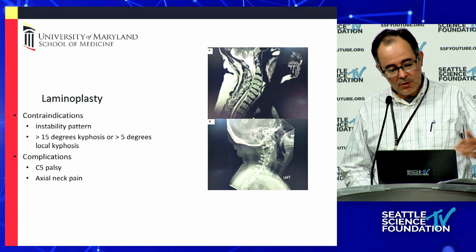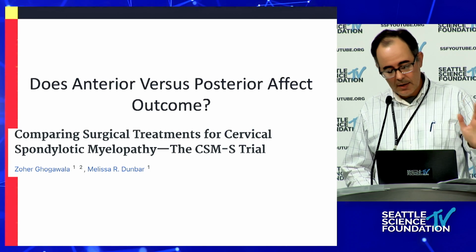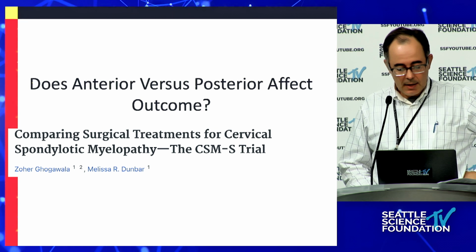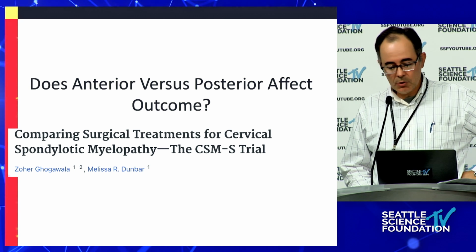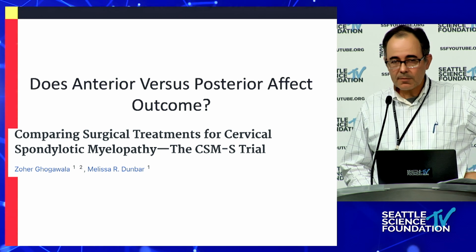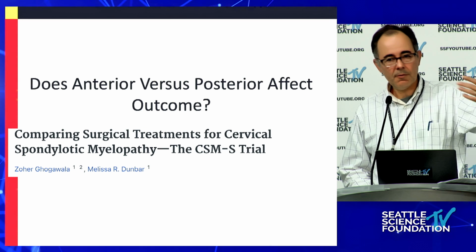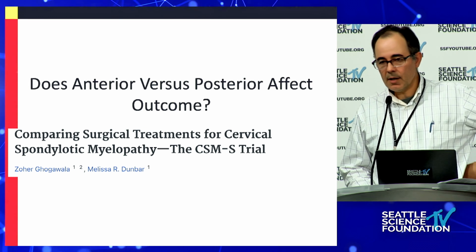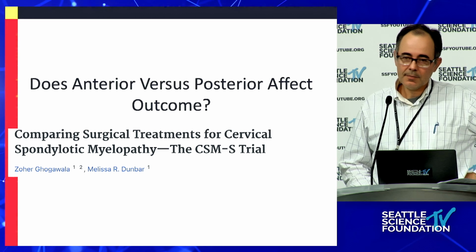There are a couple of different ways to do laminoplasties, but I'm running out of time here. But bottom line is, I think there are a variety of ways to preserve motion, and you can be creative about it, and potentially save the patients from having a multitude of fusion surgeries down the road in their life.